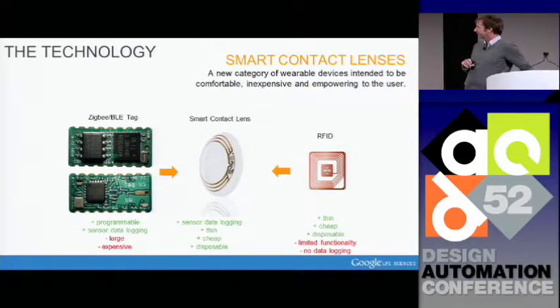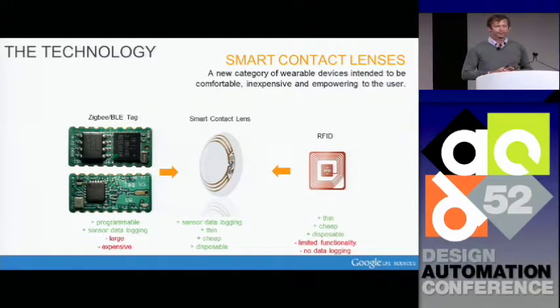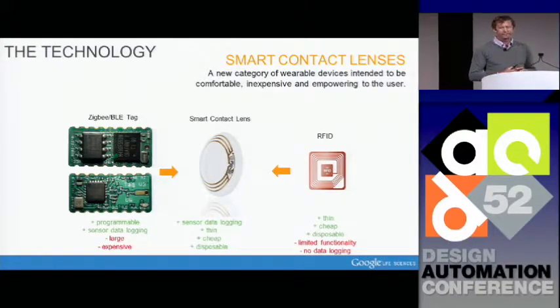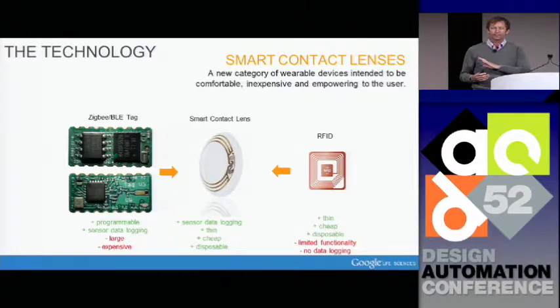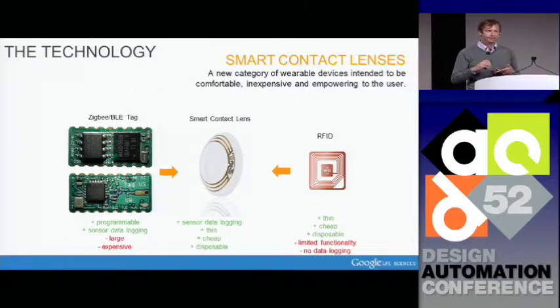On the far left, this is your typical wireless sensor node type of device. The design methodology here, at least what we have done in the past, is, okay, you have some specifications. You want to deploy a ton of these sensors. You need to make them small and cheap. So you're going to scour the earth for the best SoCs and ASICs that are out there. If those don't meet your specifications, you may have to design your own SoC or ASIC for the application. These devices would be validated, packaged, put on a printed circuit board with some surface mount components, a battery, antenna, et cetera. This is beautiful.